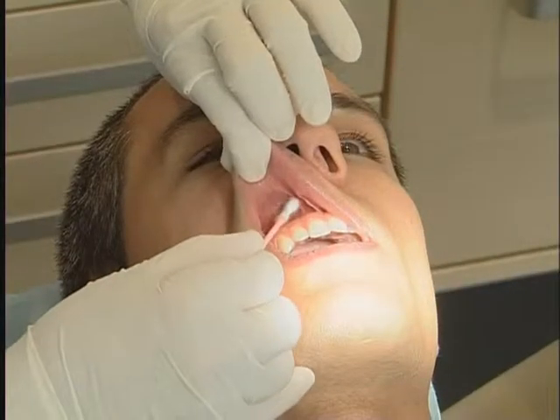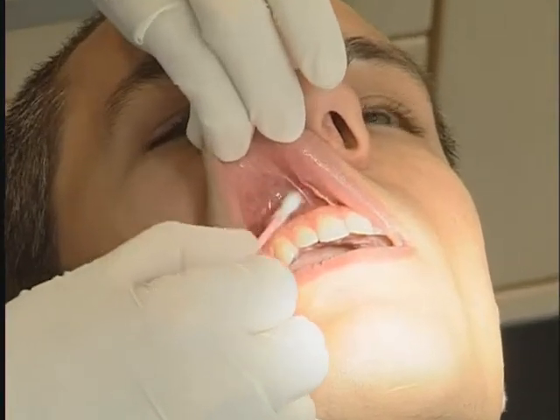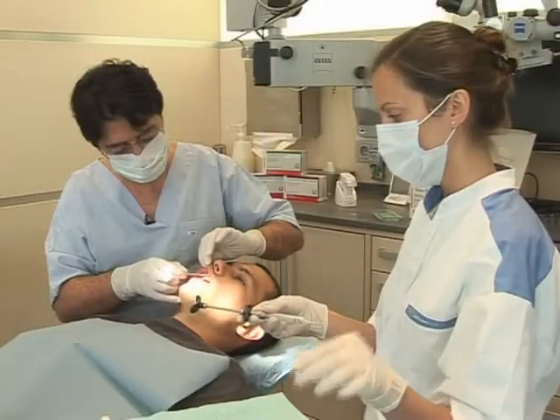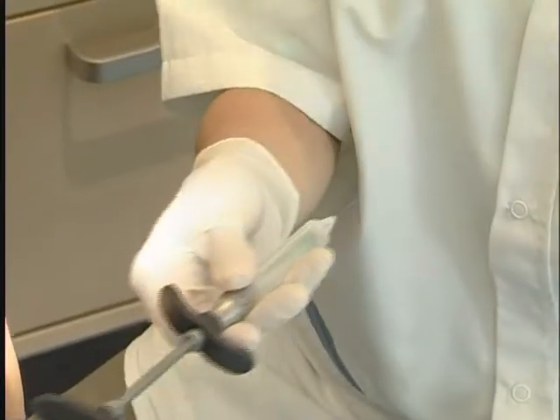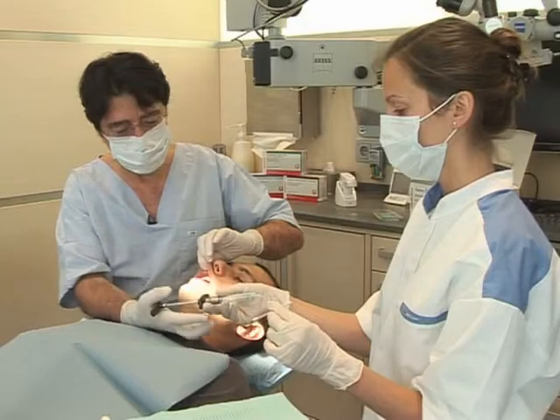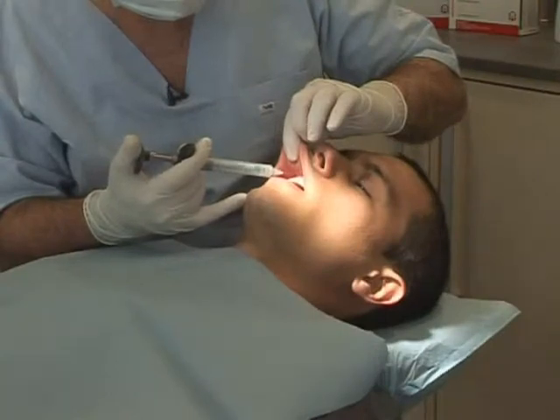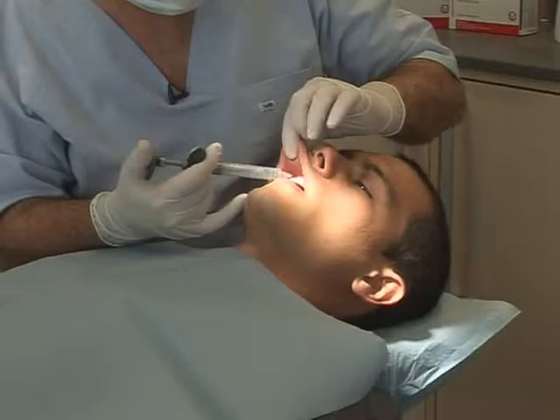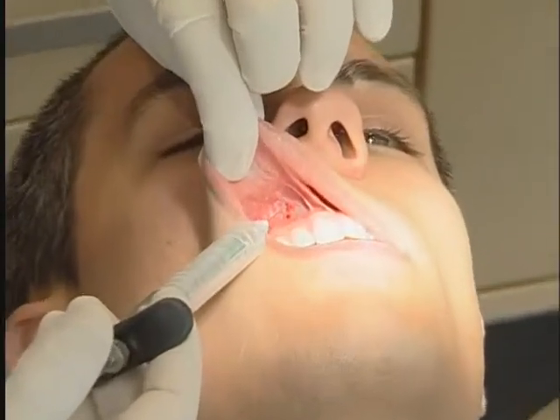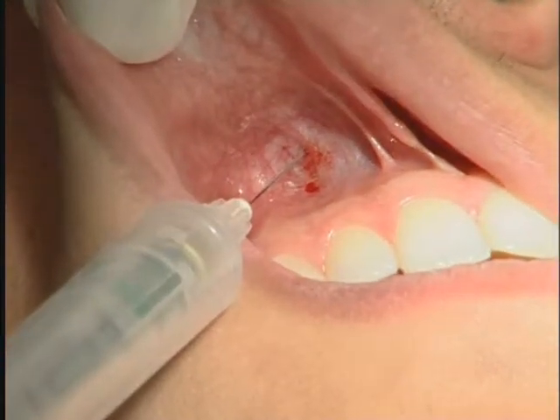Clinical studies evaluating injection pain suggest that this stage is justifiable in the anterior maxillary region. After checking the prepared injection syringe, the tip of the needle is positioned in the mucobuccal fold with the bevel facing the bone. Keeping the lip under tension, ensure clean and painless penetration into the mucous membrane.